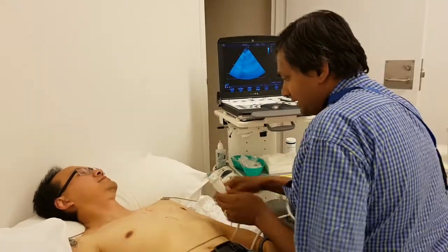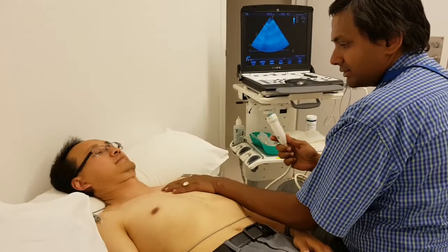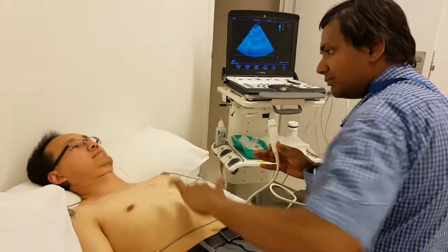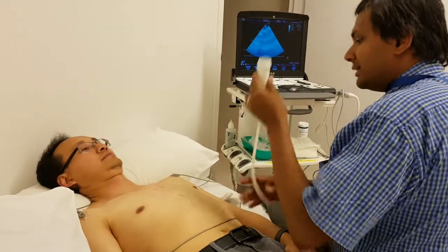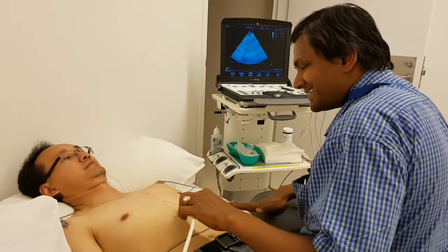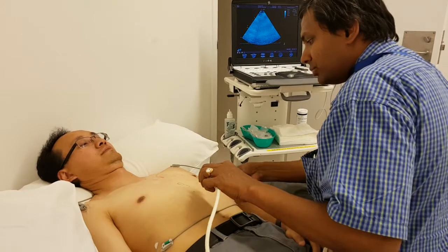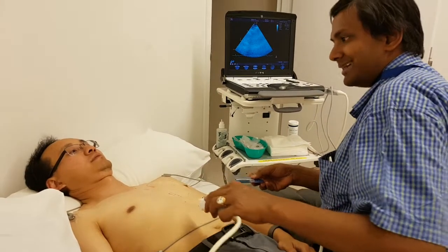For the subcostal view, the subcostal view looks at the same heart from the right side, from the abdomen, and we use the liver as a medium for the ultrasound to go through. There are two views for the subcostal: the four-chamber view is also a coronal view like the apical four-chamber. With the apical four-chamber, we get a coronal view from the apex; here we get a coronal view from the right side.